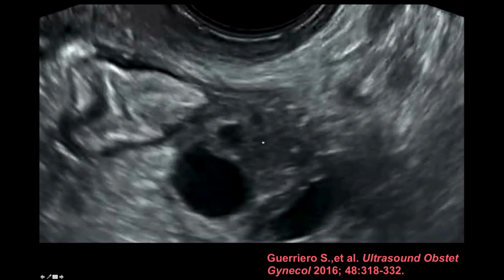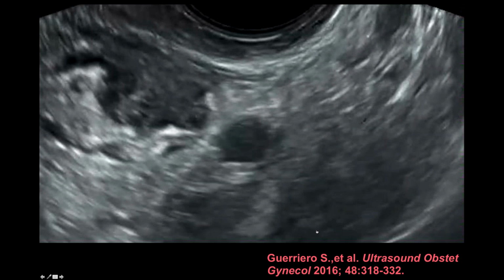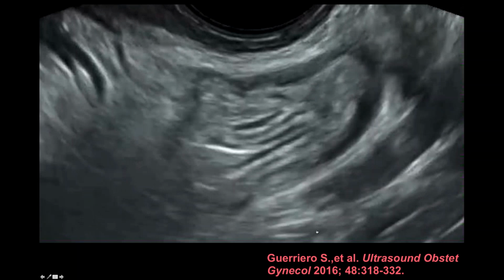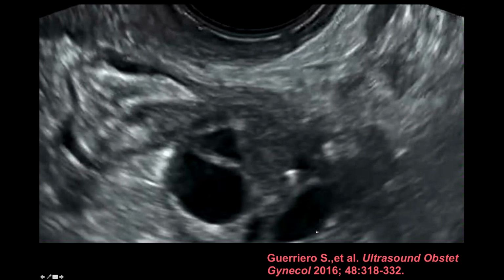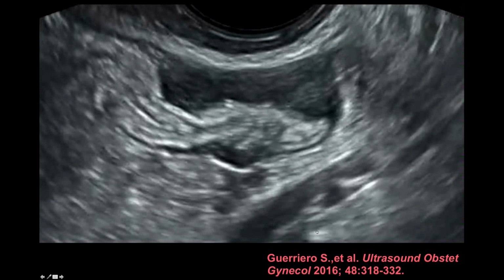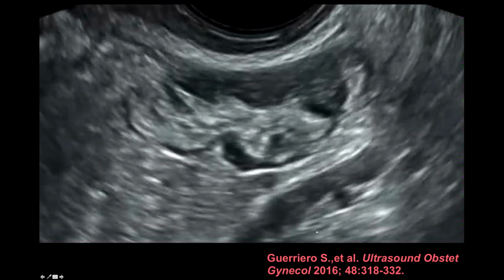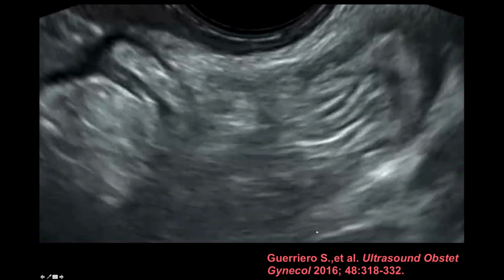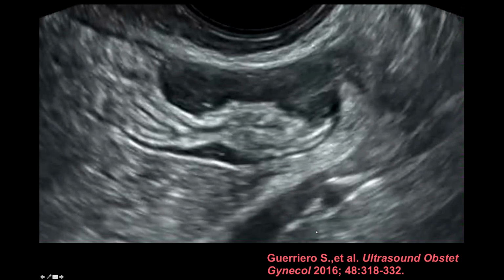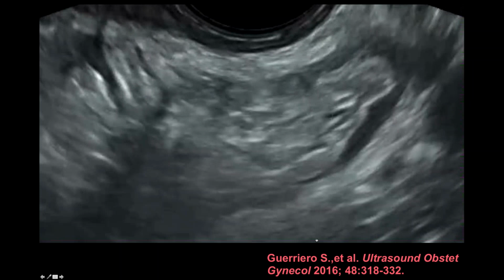and that's the ovary. So we didn't used to think that we could see these things on ultrasound. We used to always think you either needed to do a laparoscopy or at least an MRI to be able to diagnose or see deep infiltrating endometriosis. But the problem was we weren't looking and we weren't trained to look. You can find these lesions if you know how to look for them. And if you get this paper, it goes through step by step what these things look like and how to look for them.